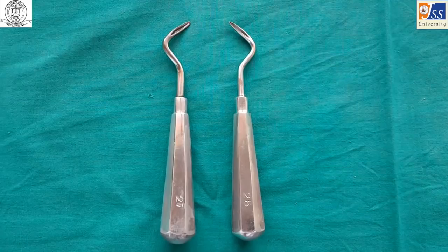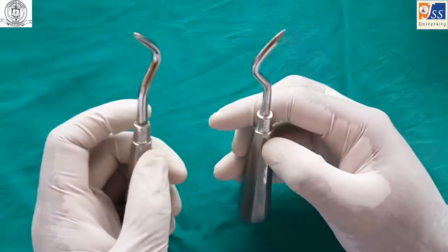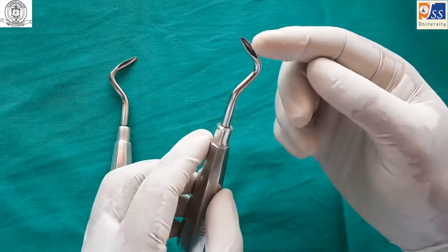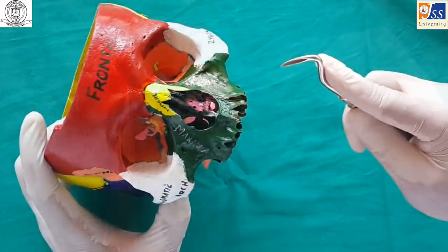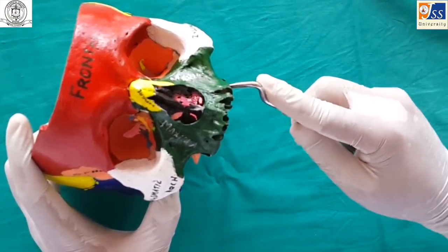The Apexo elevator is a paired instrument. It is held in a palm and thumb grasp. It is used for the removal of fractured root tips or apices, and is primarily used on the wedge principle.